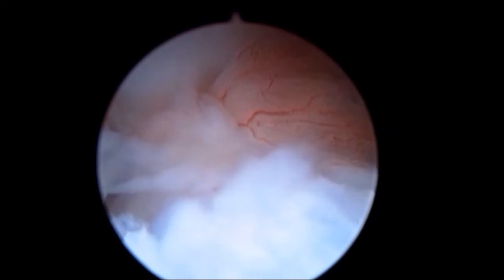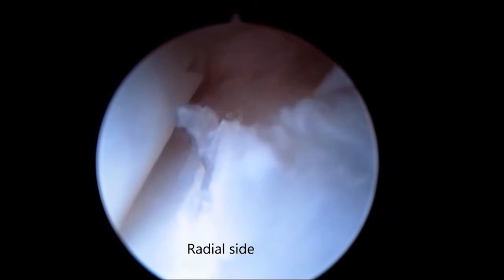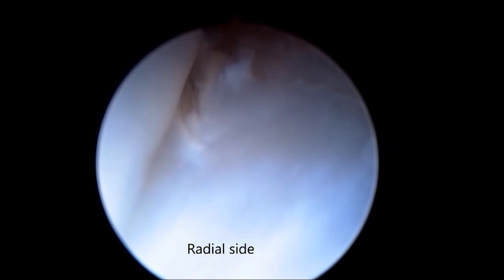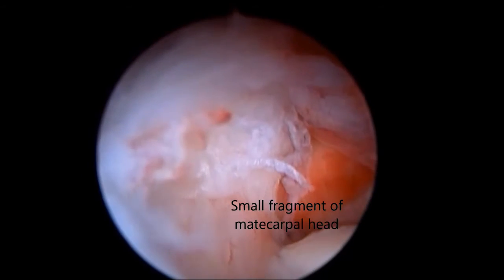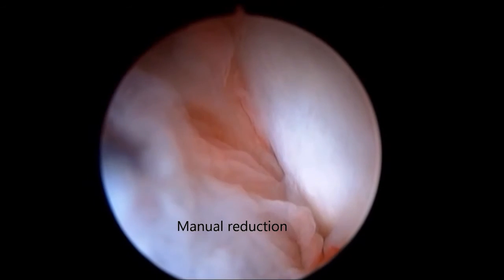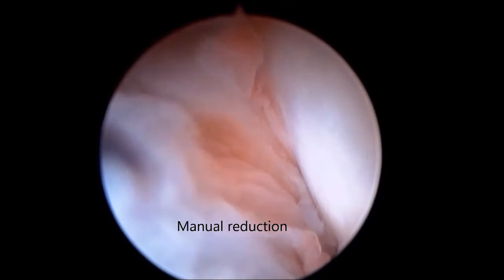The volar plate was positioned on the metacarpal head. As we move backward, we can see the proximal detachment of the volar plate. A small fragment of the metacarpal head was seen under the volar plate. We tried to reduce the dislocation from outside the joint, but it was irreducible.